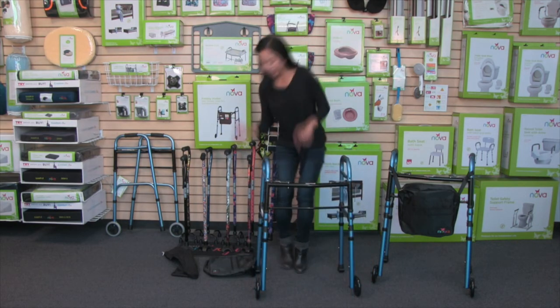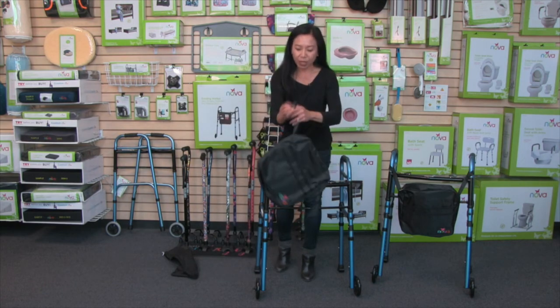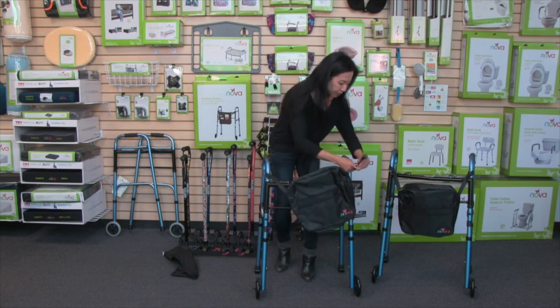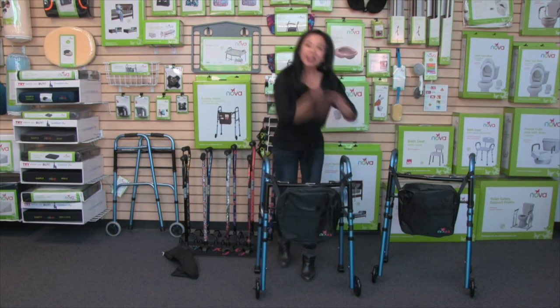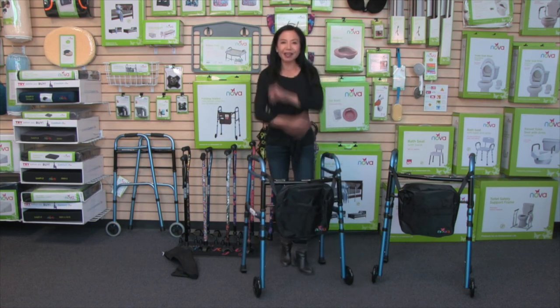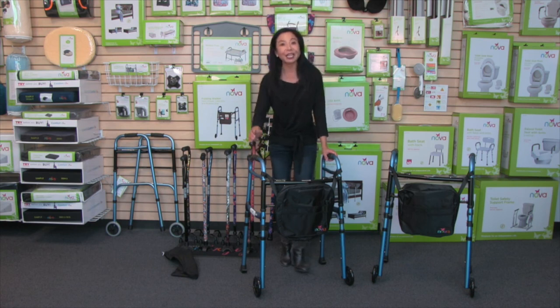Lastly, you just attach the bag — there are velcro straps and it's so easy to attach to the bars. And there you go: it's all assembled and ready to go. That is the folding walker with the bag, wheels, and the glide skis. As with all of our products, it comes with our care, use, and contact information, so you can reach out to us anytime.